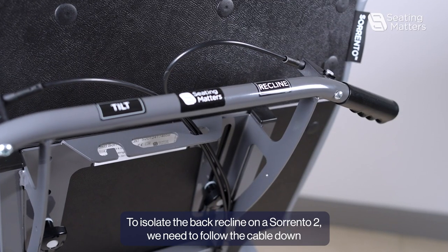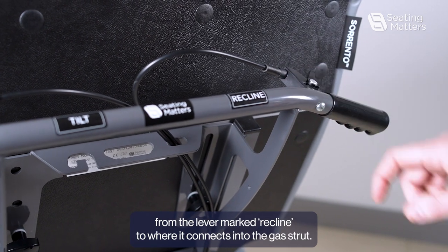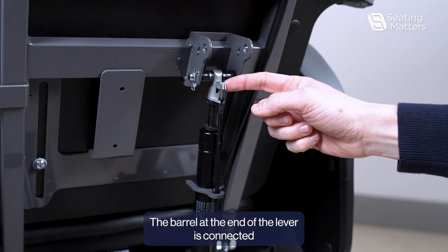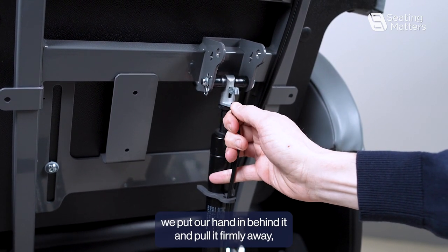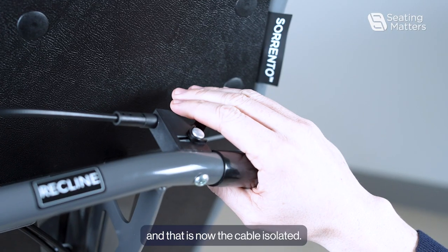To isolate the back recline on a Sorrento 2, we need to follow the cable down from the lever marked recline to where it connects into the gas strut. The barrel at the end of the lever is connected into the head of the gas strut and it is also clipped in here. To release it, we put our hand in behind it and pull it firmly away, and that is now the cable isolated.